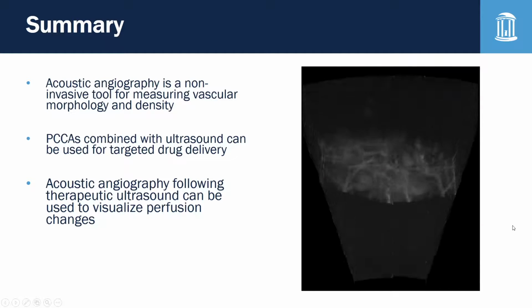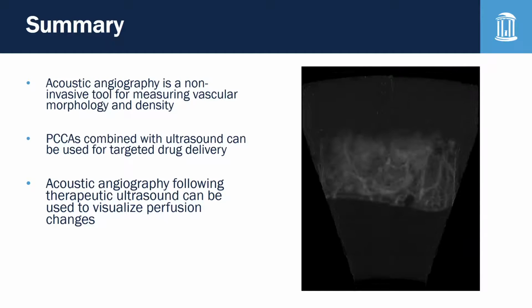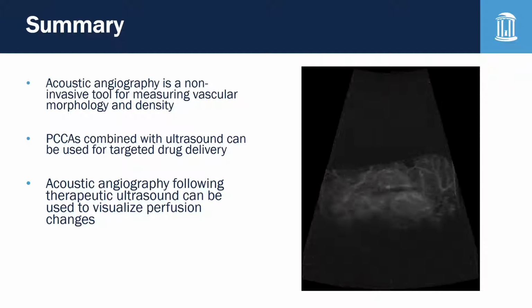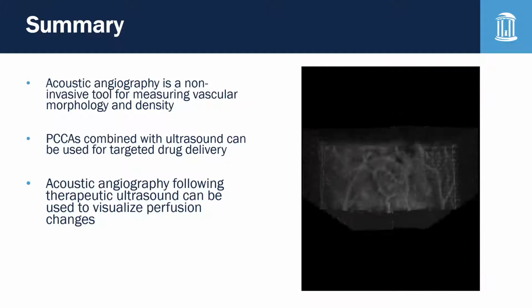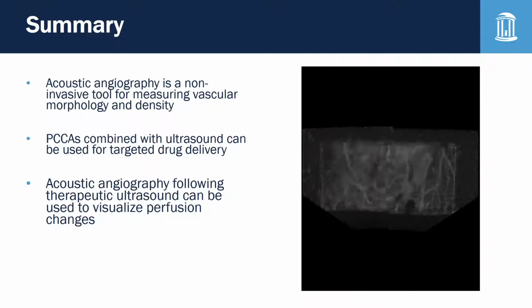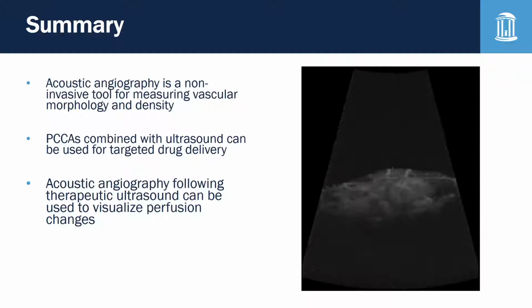In summary, acoustic angiography is a non-invasive tool that can help to visualize vascular perfusion. Phase change contrast agents combined with therapeutic ultrasound can be used for targeted drug delivery, and perfusion changes relating to therapy can be visualized after treatment using acoustic angiography.